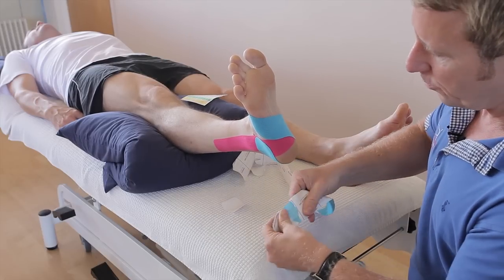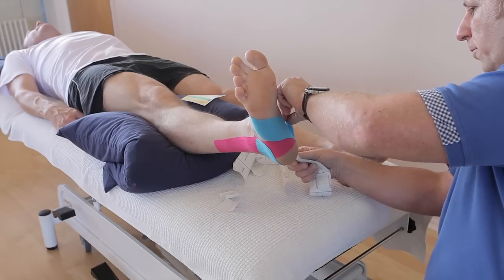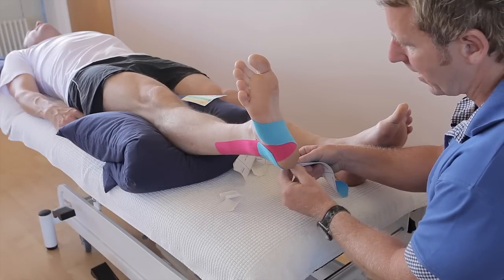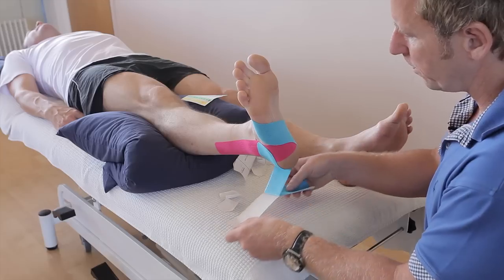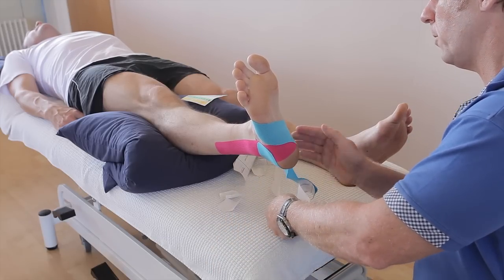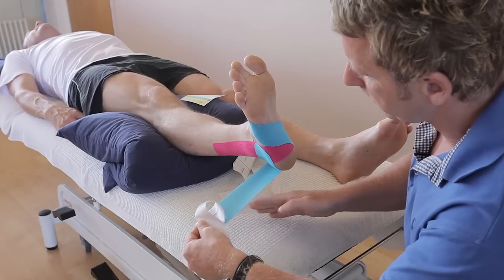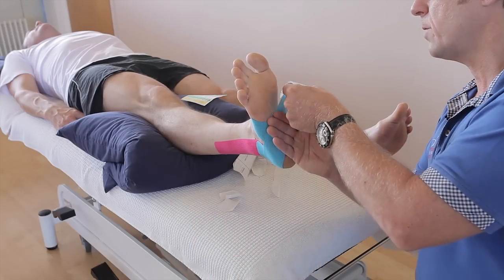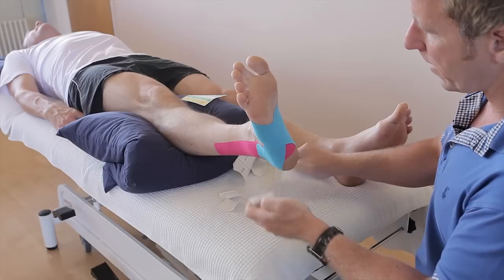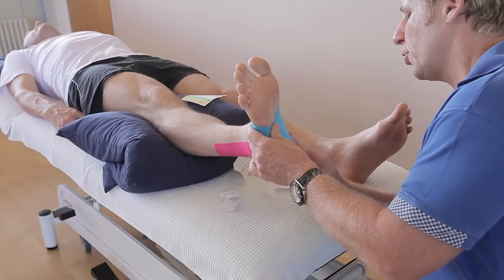Break the first square of the final piece of tape. Coming from the inferior part of the medial malleolus, lock that down and pull it — break the back in — then peel that to the end. Then just literally place it there, and from there 50%, then 100%, and bring it around. That's going to finish on the dorsal surface. Then using the back of the tape, we can just heat activate the glue for a few seconds.